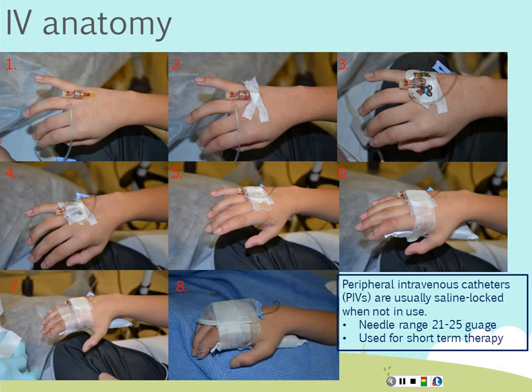So the best way to secure the peripheral IV in a child is, like we said, once it's placed, secure the actual catheter itself, as you see right there. On the catheter is the tape. Then you have that extension tubing hooked in. It is covered with an occlusive transparent dressing where you can see the insertion site. On top of that, you see there is a handboard, so they can have a handboard, an arm board, or something like that, and then you have an IV house.